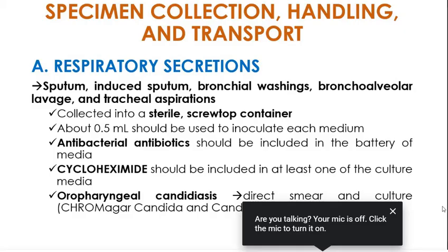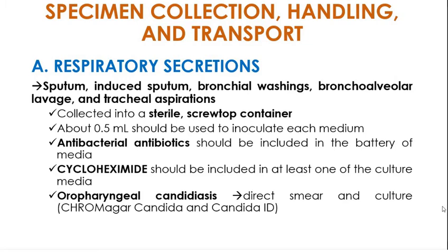Which most of them naman are slow growers. Pero meron pa din tayo ng mga fast growers na fungi. So, yun lang ang medyo inhibit natin ang growth. Now, for when it is with entertaining oropharyngeal candidiasis, and we already can do a direct smear and then culture.